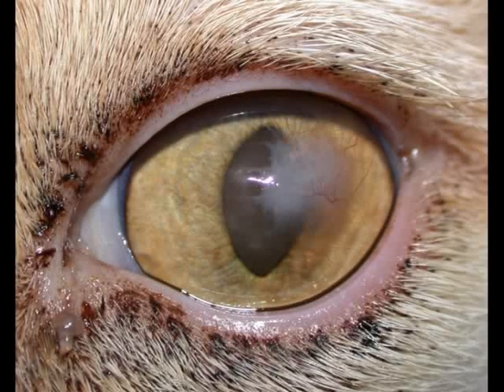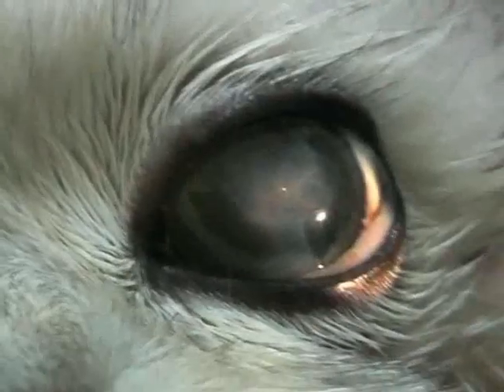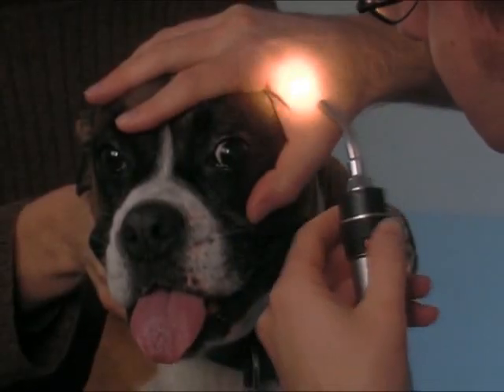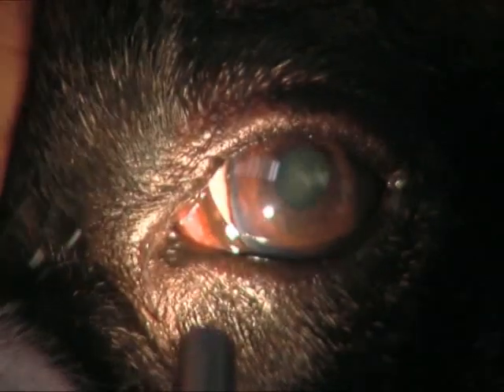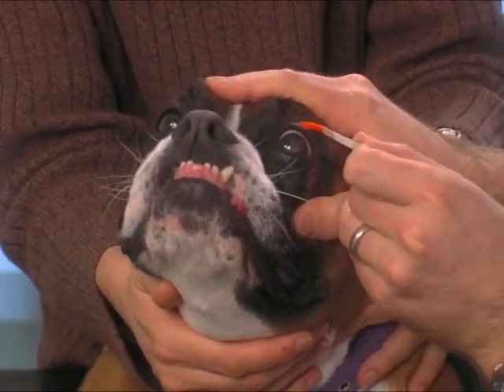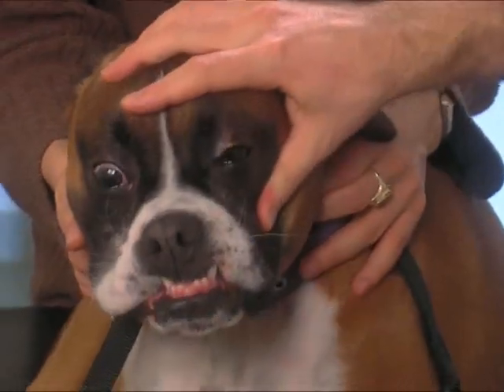Healing of damaged corneal stroma frequently results in scarring. Without the aid of fluorescein, scarring can be difficult to distinguish from corneal ulceration. Fluorescein testing is essential in all cases of corneal disease to establish whether ulceration is present. This is best done later in the examination as the dye interferes with other procedures.